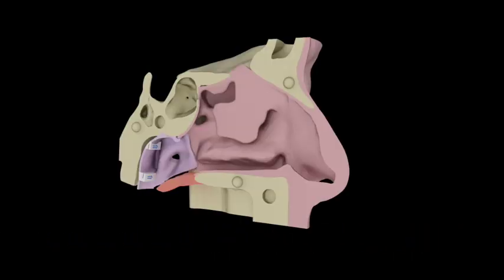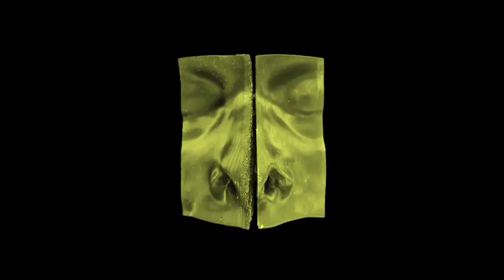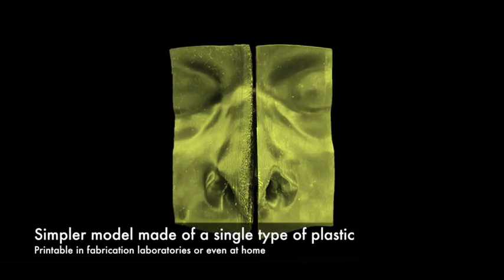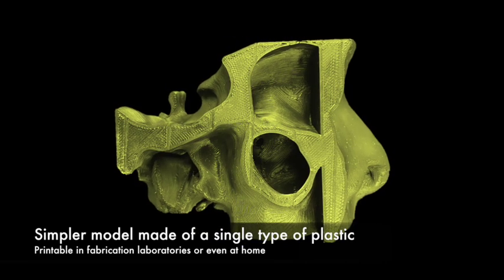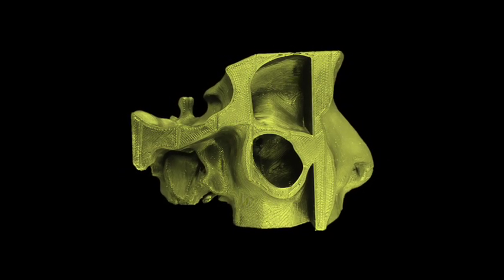This multi-material simulator can only be printed by a Polyjet 3D printer expert working in a university department or research facility, or professionally by a company specialized in 3D printing. We also developed a simpler model made of a single type of plastic, so this simulator is cheaper and can be printed by a non-professional 3D printer using fab labs or even at home.